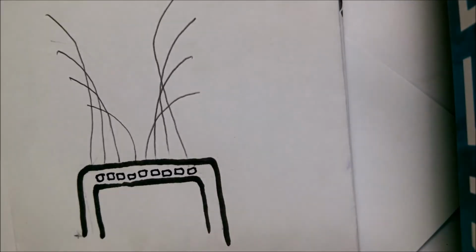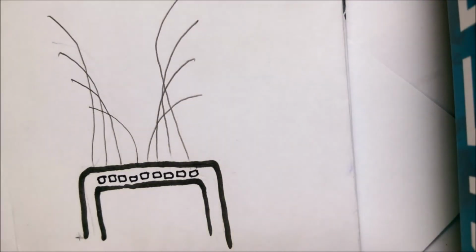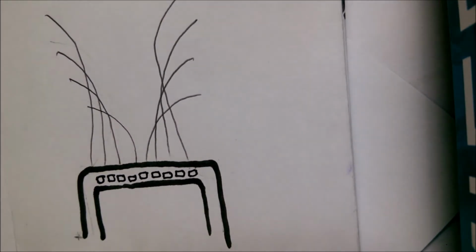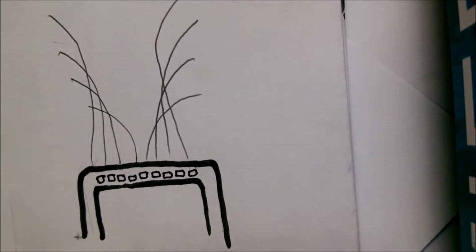During this receiving period is where dynamic aperture comes in. Assuming this is a transducer at the receiving period, the dynamic aperture will function to achieve improved lateral resolution in an ultrasonic imaging system with a linear array of transducer elements, especially at ranges less than the full array aperture.